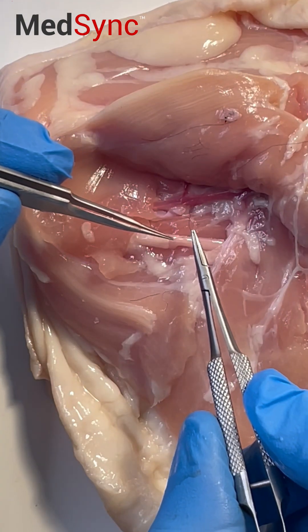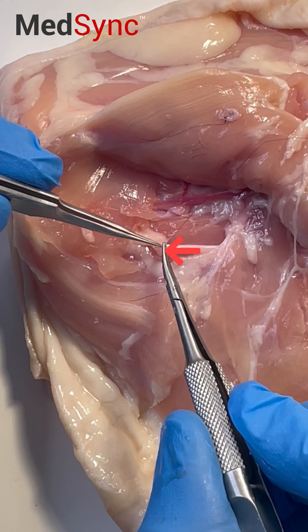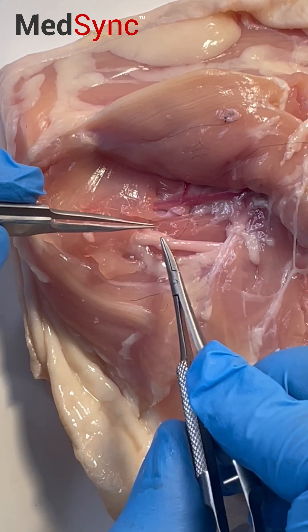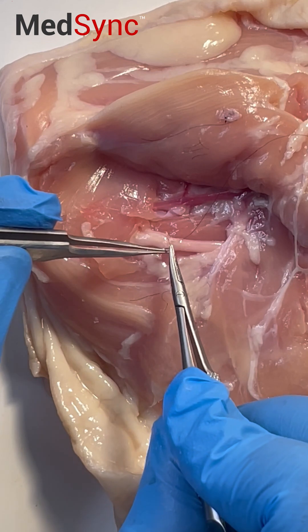Hold the epineurium, which is the outer lining. Place your needle against it and rotate, keeping traction on your forcep until your needle has come all the way through. Pull the suture, mount it early, and continue on the opposite side.